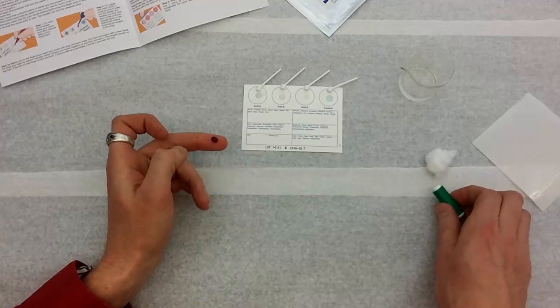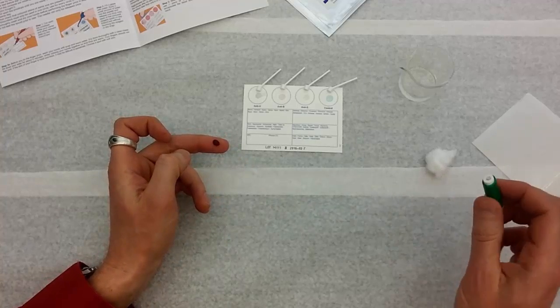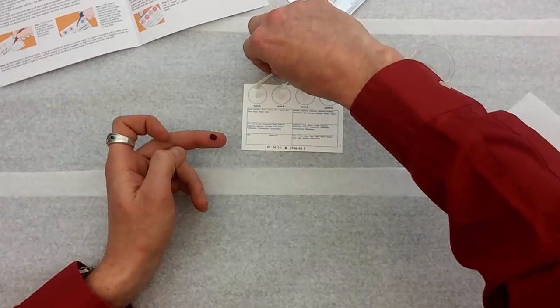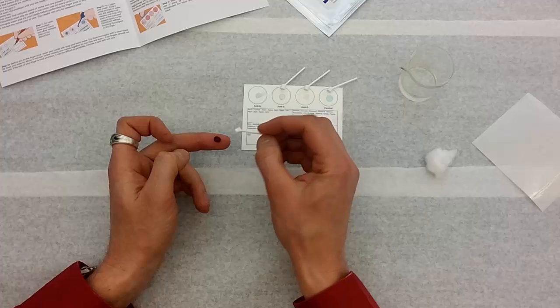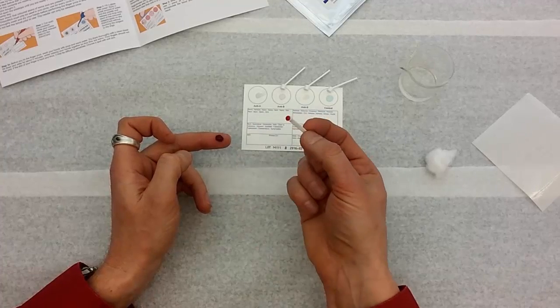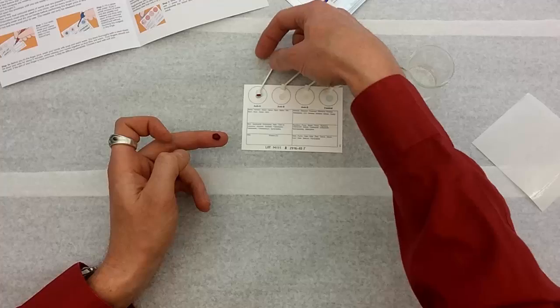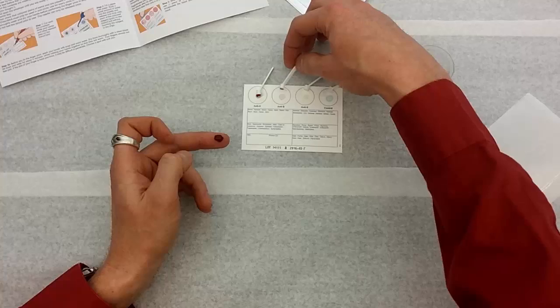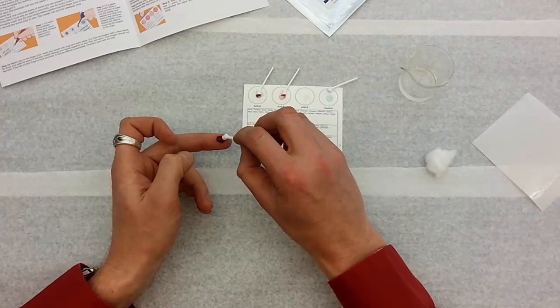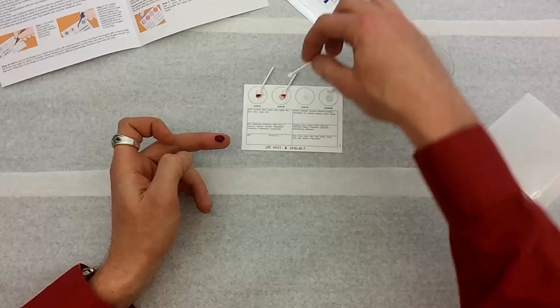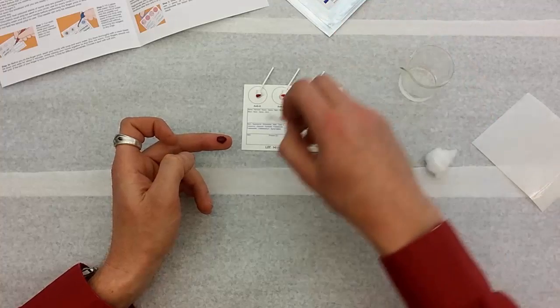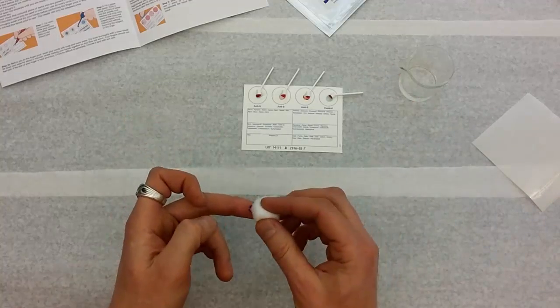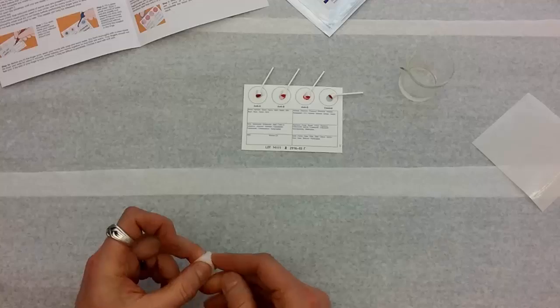Now I've got a good blood sample. And this is, now there's no way to use it again so it's gone. The next thing to do once your blood starts, grab one of these little spatulas and get a little sample. It doesn't take much, just a little drop there and set it in the liquid. And then do that for each of the spatulas. Blood sample. And blood sample. Now I'm done with the bleeding, I can put a cotton ball over my wound.